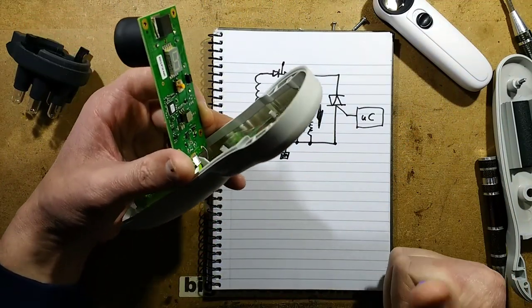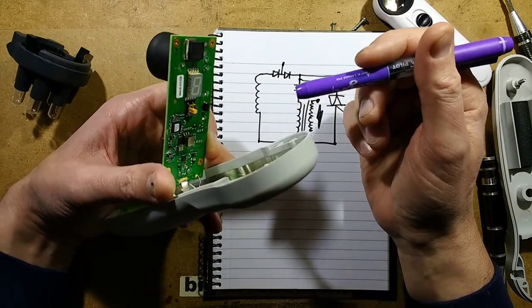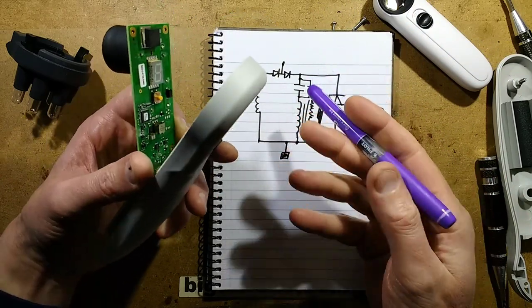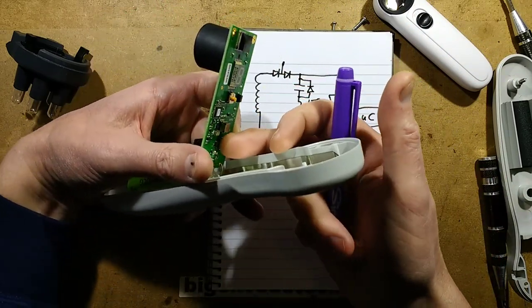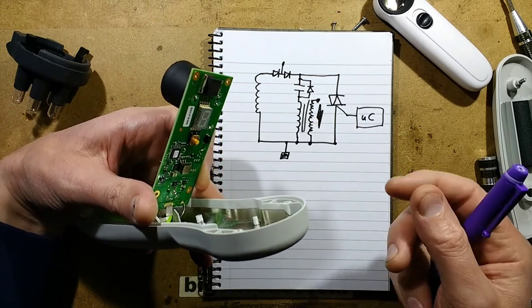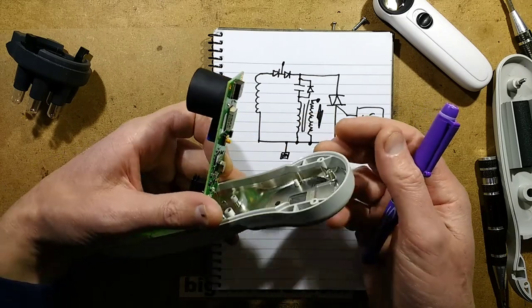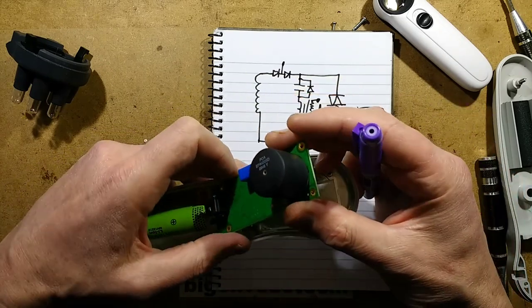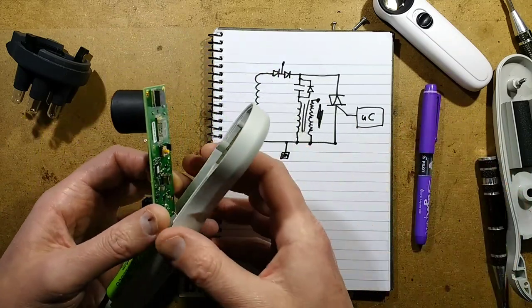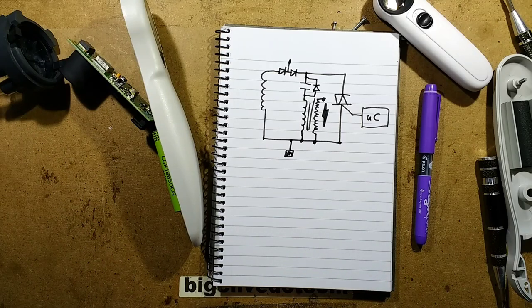The bulk of the work is probably in the software. The software has the functions of detecting the battery charge status, which is probably down to this little chip down here - a battery charger monitor chip. It can monitor when it's charging and the state of charge. Also it acts as a 15-minute timer, so when you turn this unit on it will turn off 15 minutes later. That's considered one treatment, although 15 minutes must drag because that's quite a long time.